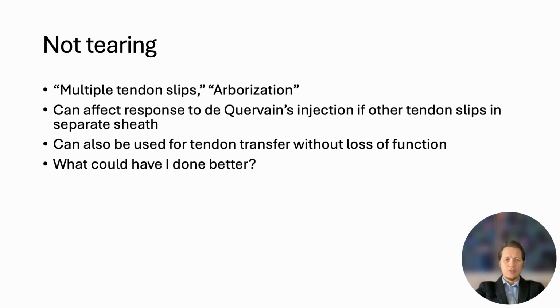But as I like to finish up and review here, things I could have done better, of course: do the other thumb. That's the wonderful thing about ultrasound. You can't do another MRI on the other hand. Insurance, that's just a tough thing with insurance. That's a no-go. But ultrasound, you just bring it on over. I did not do that in this situation.